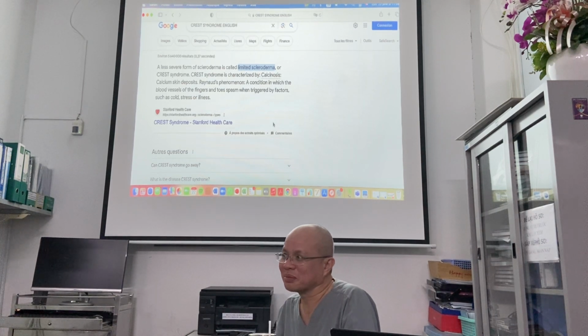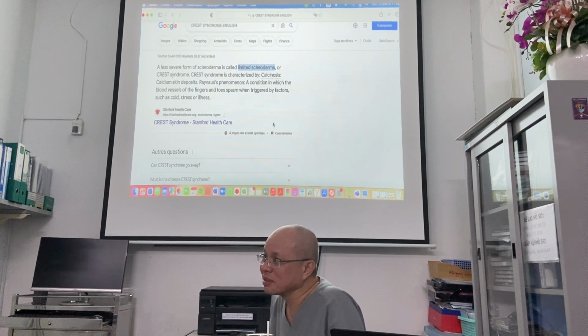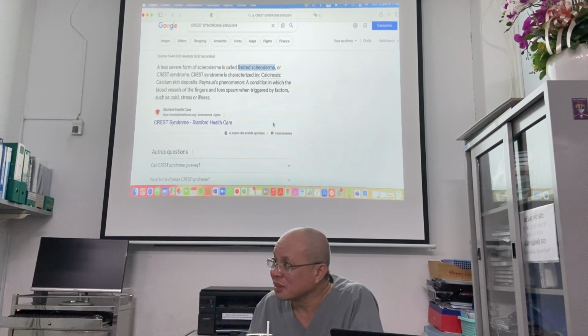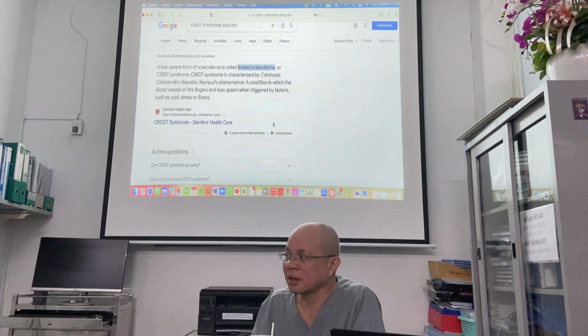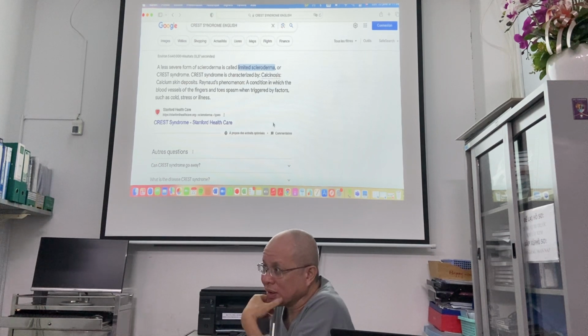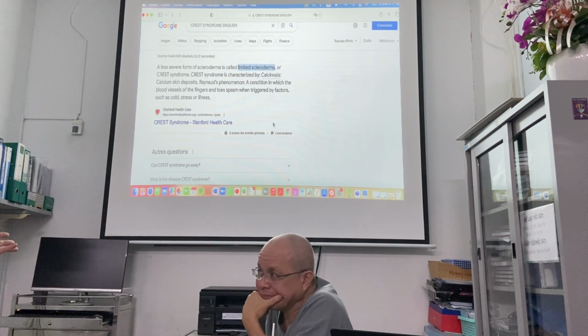Then the surgeon came, and they wanted to send the patient for surgery. I said, don't send the patient. She has pulmonary hypertension. The outcome will be very bad. And I said to Vladimir, you know what I said? We will put an Angio-Seal. Because I had seen at my complication course in Lausanne, a doctor from Bulgaria presented a case and he put an Angio-Seal.